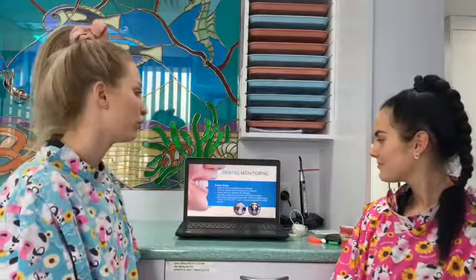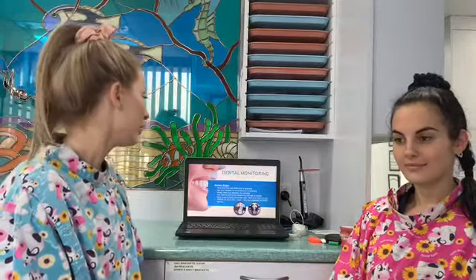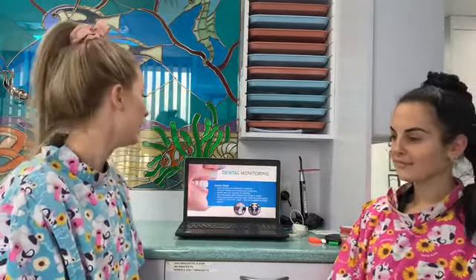So just some golden rules before you take your scan, always make sure you clean and floss your teeth, just because the app will pick up if you haven't brushed them. Always use your chewies for 2 minutes before scanning, because if you do have any windows or air gaps, the app is going to give you a no-go, which will mean you're in that aligner for longer. Always wear your retractors when you're scanning. We want to make sure that your lips and cheeks aren't covering your teeth. And then selfie mode and iPads can't be used just because the flash isn't bright enough.